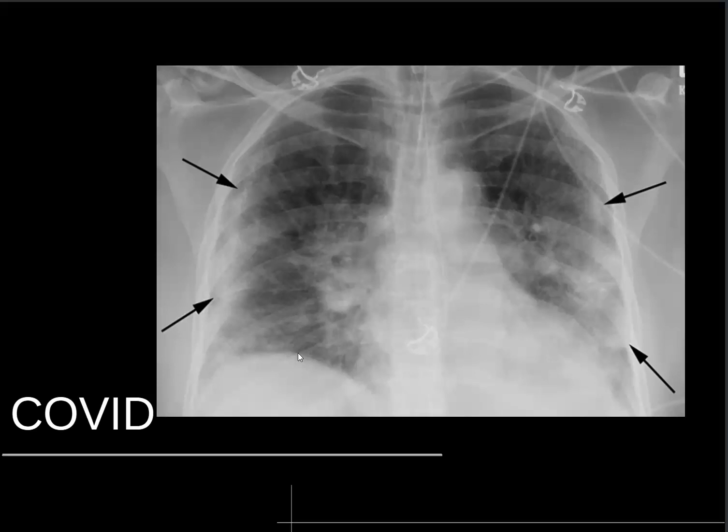When we were in hospital, we dropped everything and just concentrated on A&E x-rays, so we could tell our A&E colleagues which one of their patients had COVID, which ones had to be isolated, and which ones could be sent home. So chest x-ray was one of the most important medical tools in the diagnosis of COVID in the last 2 years.